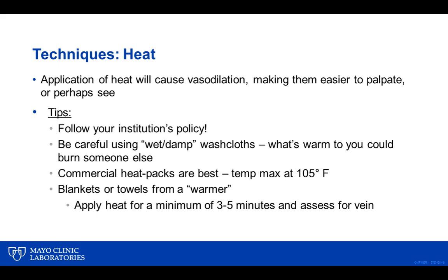So yeah, looking at great technique, looking at the differences on when you would use a warm, dry towel or a blanket from the warmer. As Danny said, you can wrap the entire arm. That's a technique when you simply haven't found anything, and now you're hoping that using that heat will cause some vasodilation so you can find a vein somewhere. The commercial heat packs, as Danny said, work marvelously on hands, where you can focus that heat on the top of the hand and help that vasodilation distend that vessel and allow you to find the vein.